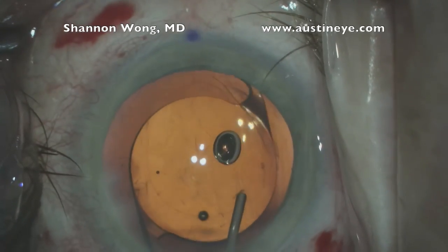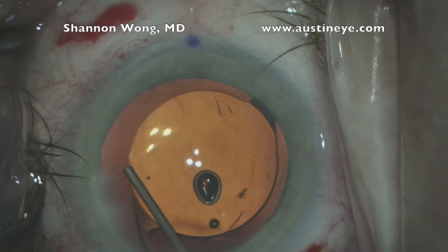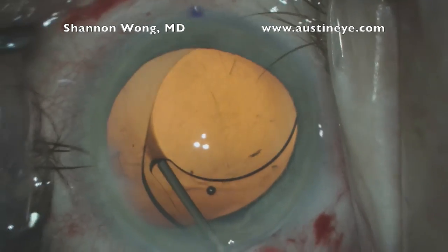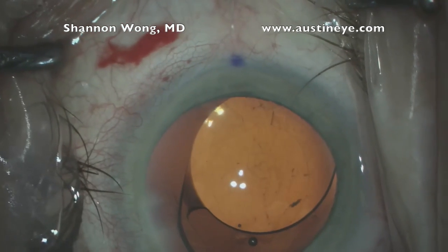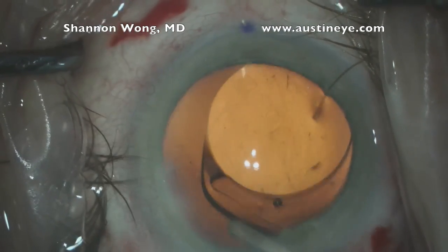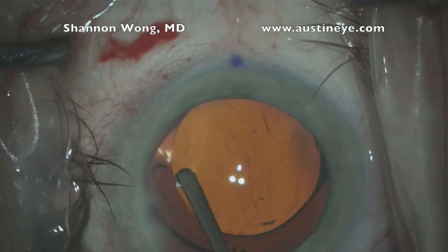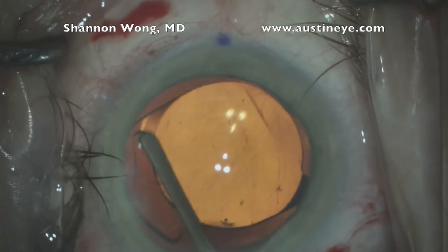The leading haptic is now underneath the anterior capsule leaflet. We push the optic, which is 6mm, into the capsular bag underneath the 4.5mm capsulotomy. We then gently rotate the trailing haptic underneath the capsular bag. We position this lens such that the haptics are essentially 90 degrees away from the anterior capsule extension.